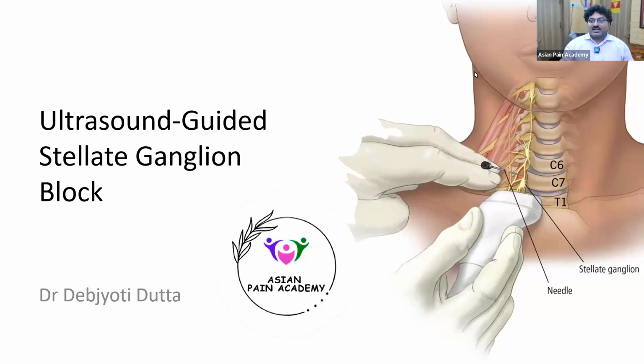So the first topic is ultrasound guided stellate ganglion block. This block is not new. For a long duration, we have been using it. Initially, approaches were blind. Even when I started my practice, I started with the blind technique of the stellate ganglion block only.